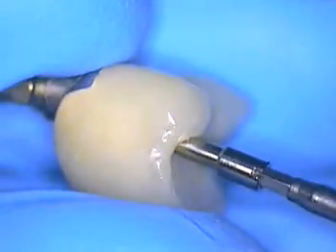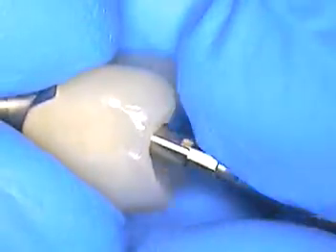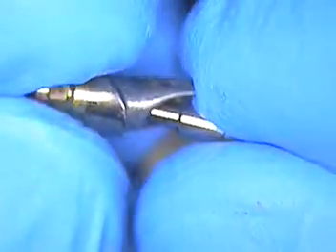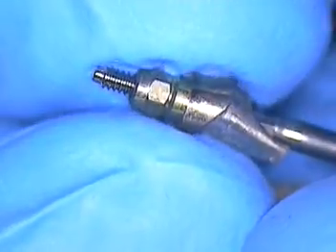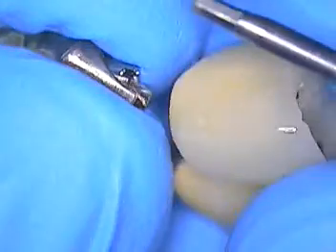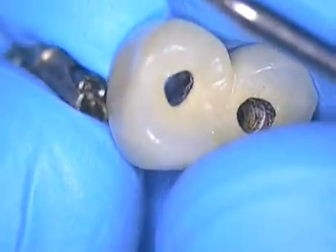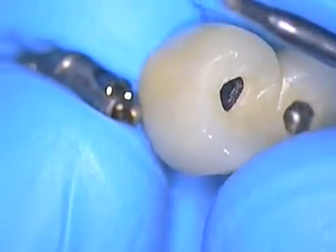This is going to go — we can't go this way with it, it won't fit. So we have to take this out, put the screw in all the way down, and then hand tighten that in place. Then this goes on top. The other one is straight-line access on 13, but unfortunately 14 is definitely out to the buccal aspect.